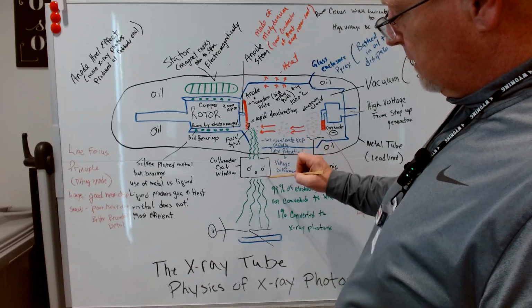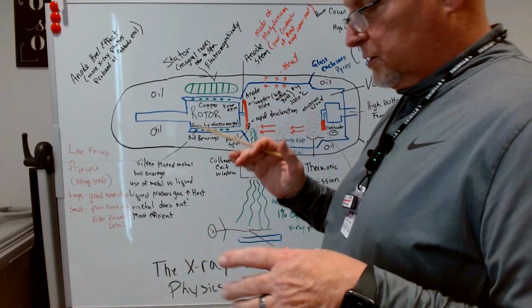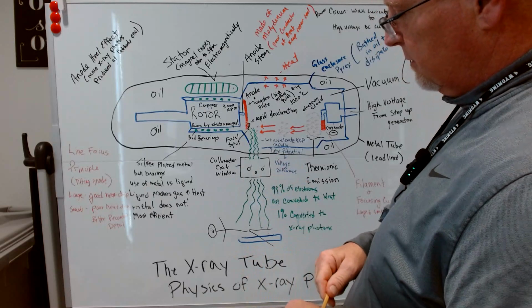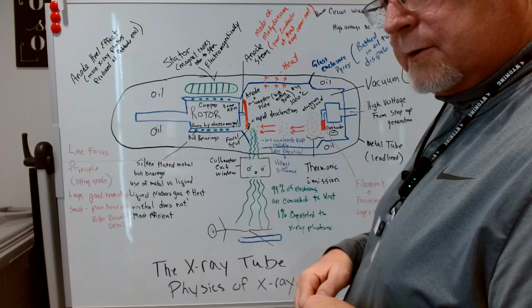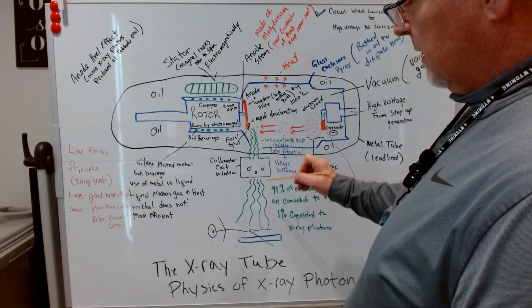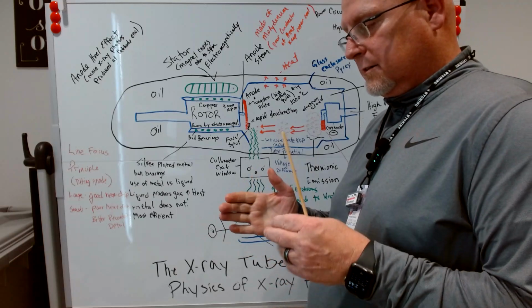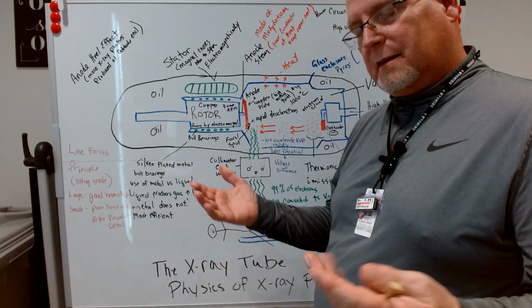You can kind of recognize the collimator. If we went out to the X-ray machine and looked at it, it's the box that has the knobs on it, right? It allows you to open and close the beam to eliminate or add beam to your X-ray. So it's a really neat setup. We're able to collimate down to the millimeter of what we want to be able to see, and the X-ray tube is only going to give us that many X-ray photons, and I think that's awesome.